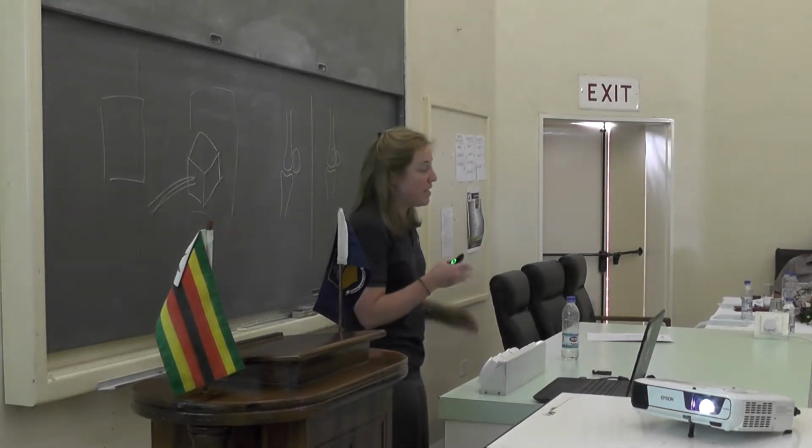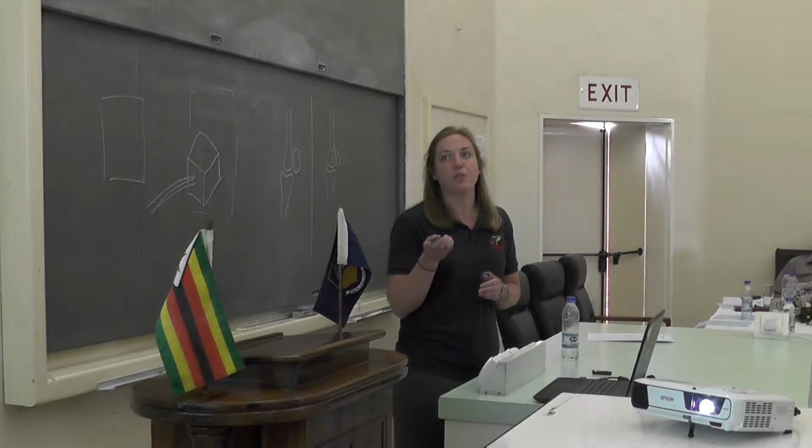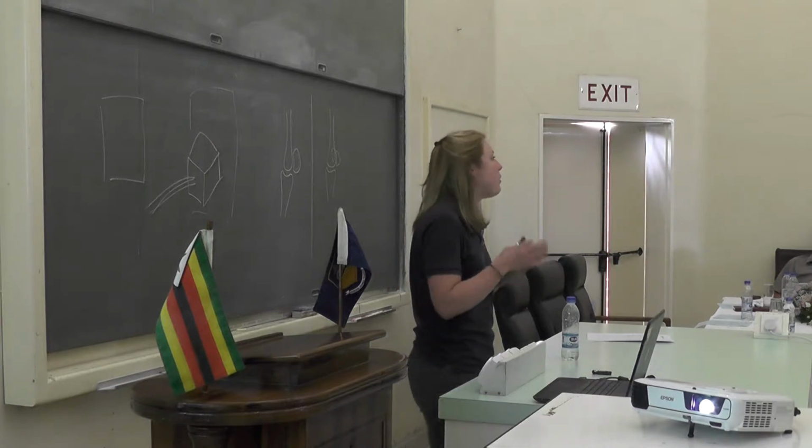But it's important to know they exist as well, should you end up needing them at some point. And then also always considering the distance. And again, this will be specific to the equipment. It will tell you on the x-ray equipment, depending on the brand and the make and all of that, but normally between 60 to 70 centimeters, or in some systems up to 1 meter, that would be a rough idea.